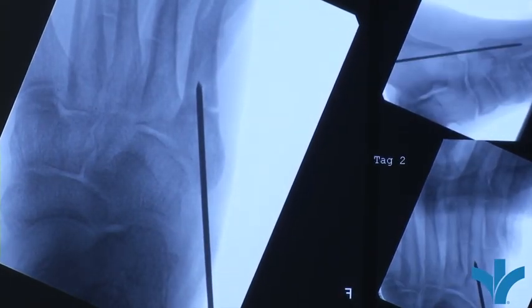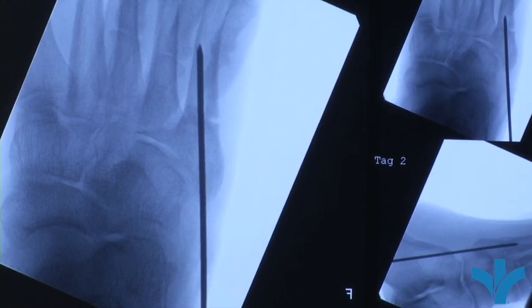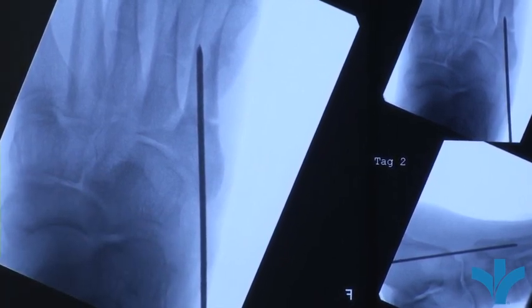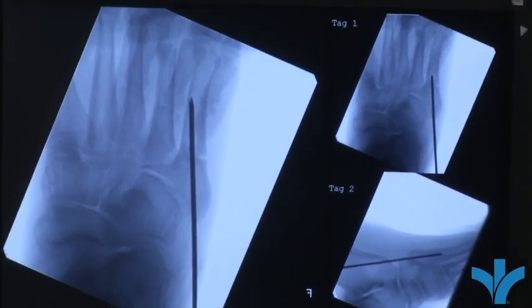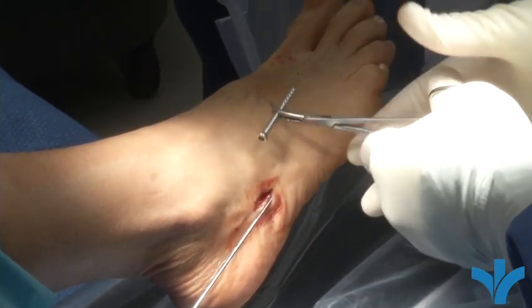Now it's pretty good — we'll just advance our wire slightly further. There are little sizer things for this, but honestly the best way of measuring is to take a screw that you think is right, hold it up on top of the foot, take an x-ray, and see if it looks correct. So we'll take a 40 millimeter screw, lay it on top and look at it on x-ray to see if it's going to be the right screw.